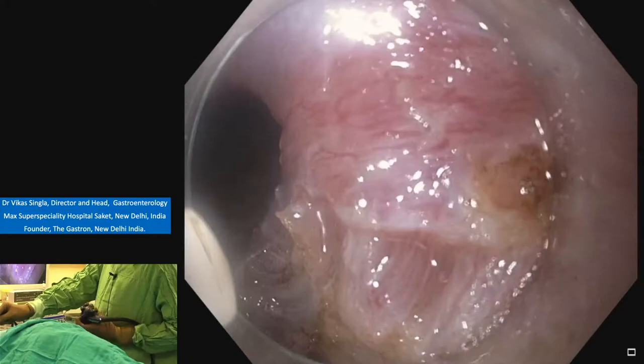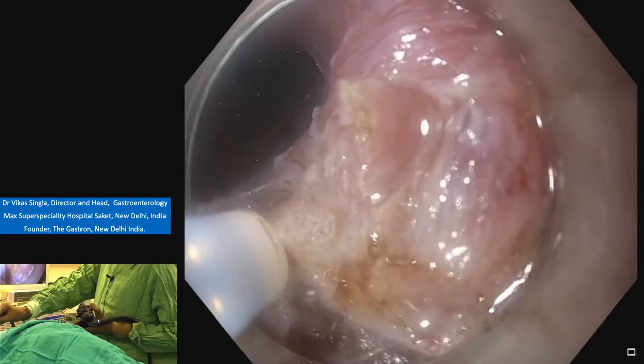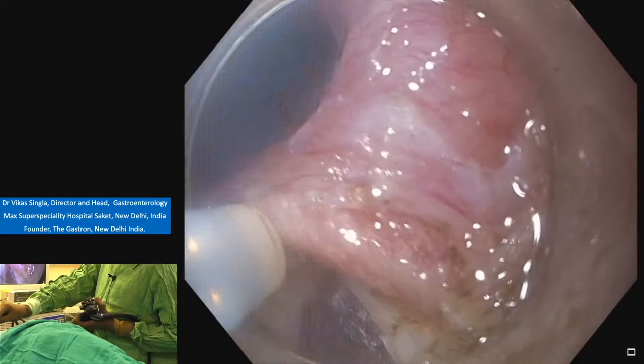One can see the vessel below. Go above the vessel and then lift. Lift the muscle away from adventitia. Last part, cut. Again, start just below the muscle layer. Lift the muscles and then use the initial coagulation, then cutting.